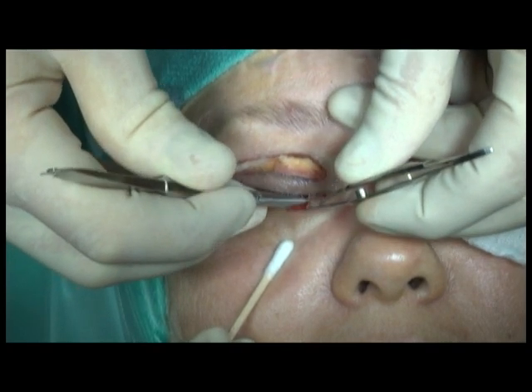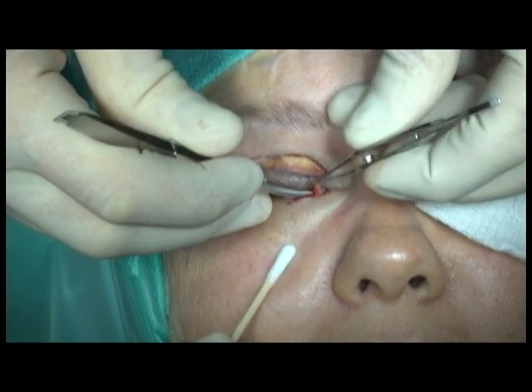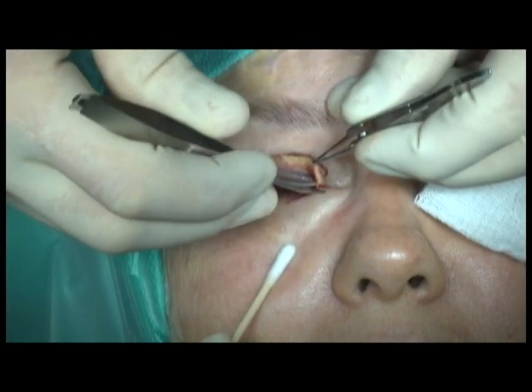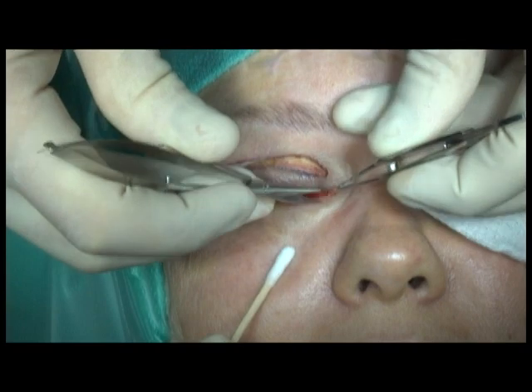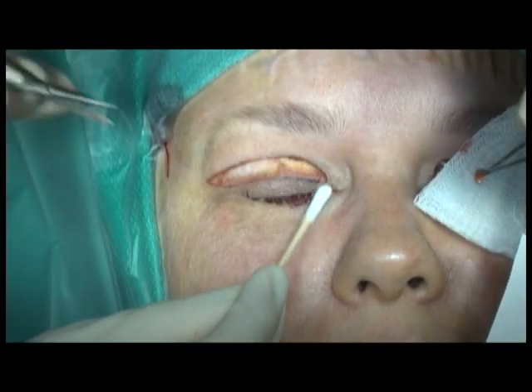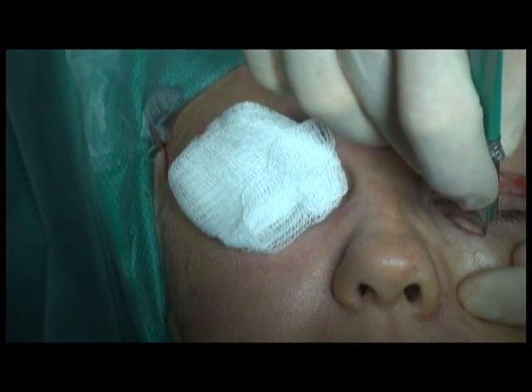Dissection is then carried out just under the xanthelasma. The deposition of material is in the subcutaneous plane and should not extend into the orbicularis. Thus, the orbicularis muscle should be preserved in order to prevent any postoperative lower lid malposition.